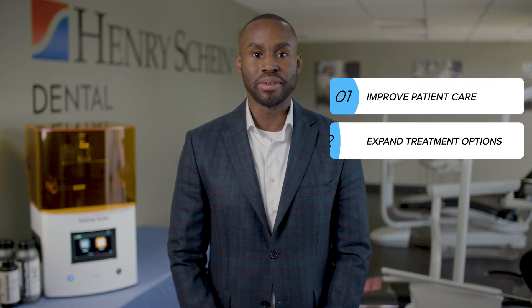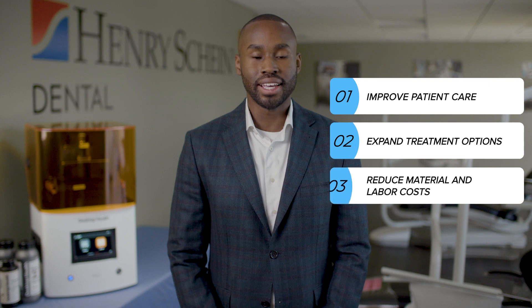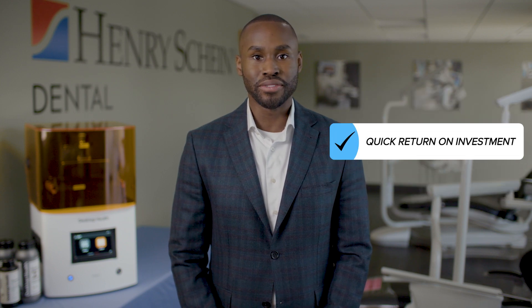3D printing offers an affordable way to improve patient care, expand treatment options, and reduce material and labor costs, all while driving a quick return on your investment.